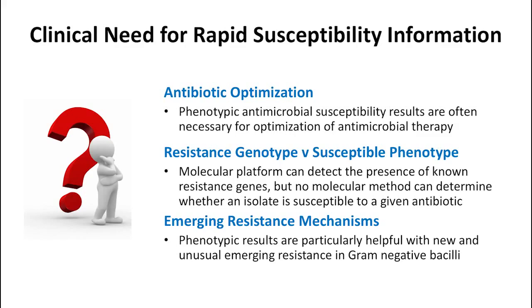You're trying to explain to me what that CTX-M means. Now, what's it susceptible to? Are you sure this is what it's going to be susceptible to? And so that is perhaps not being provided when we're just doing the resistance markers, of course.